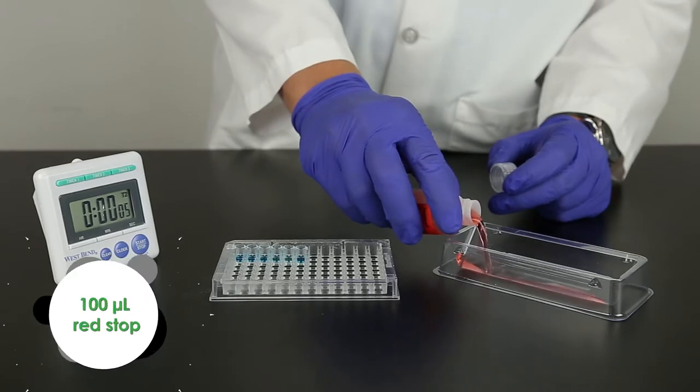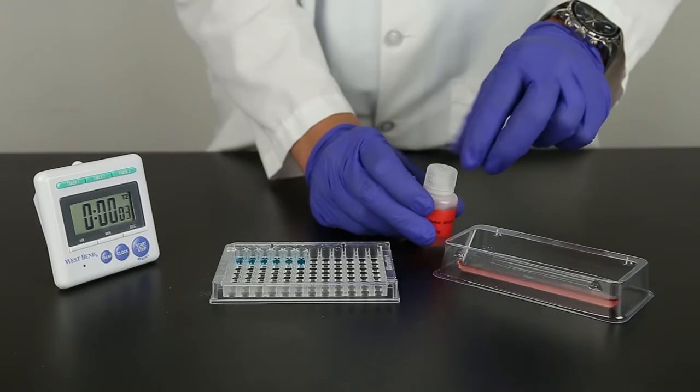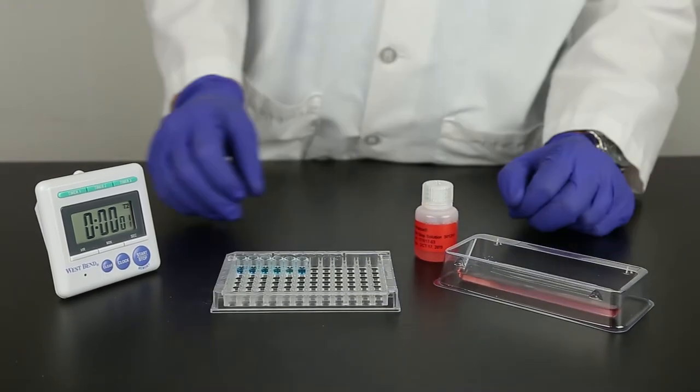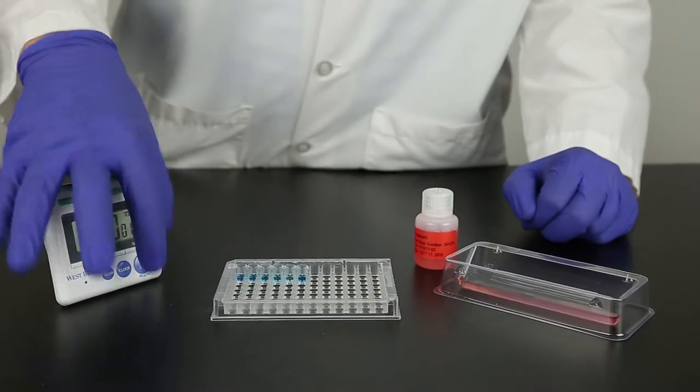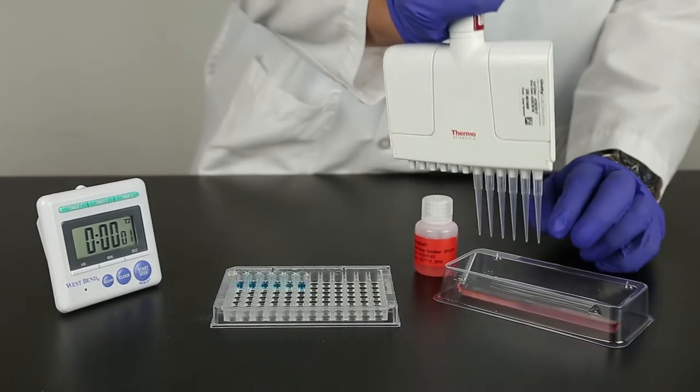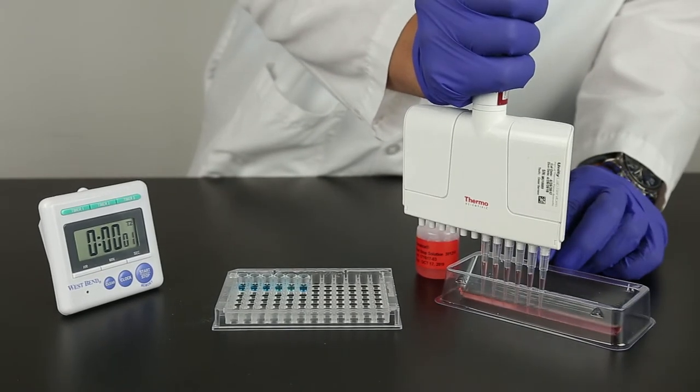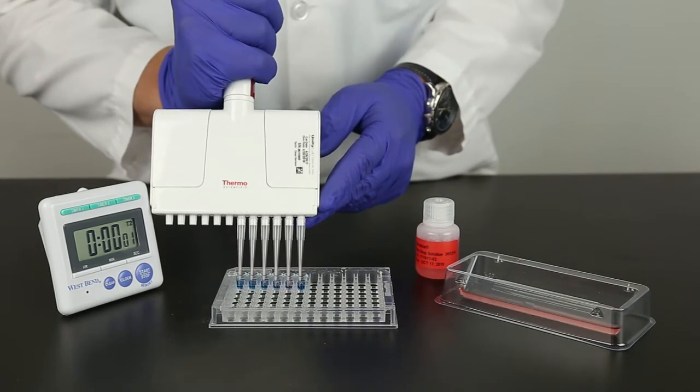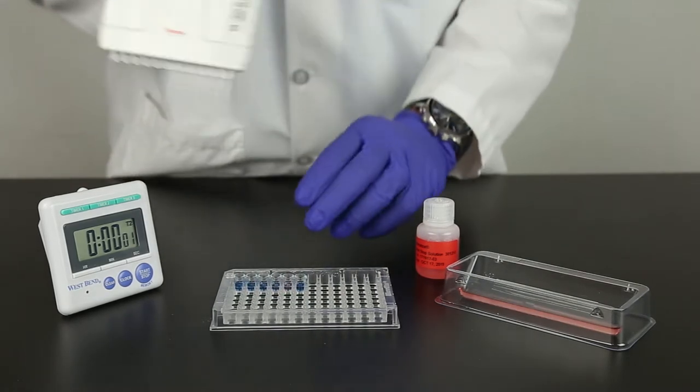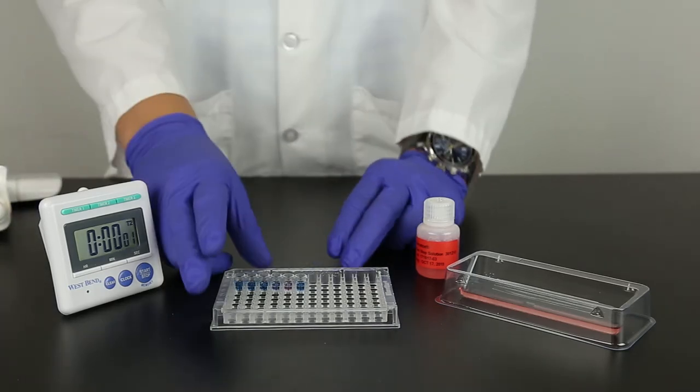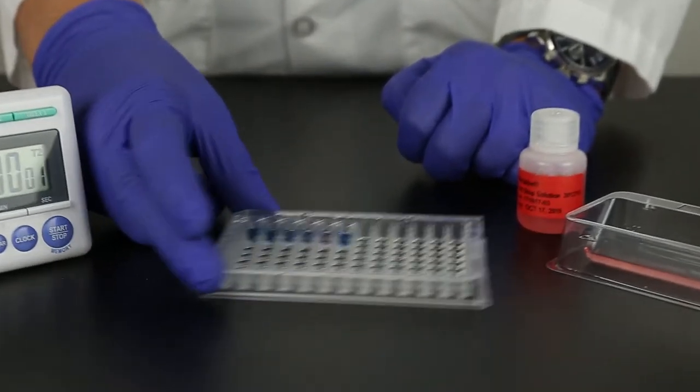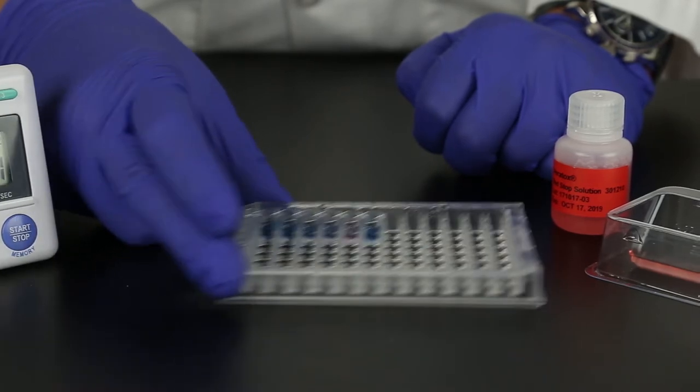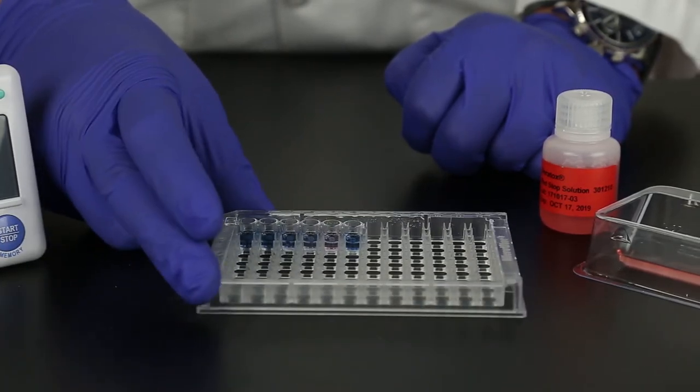Pour the needed volume of red stop from the red labeled bottle into a clean reagent boat. At the end of the five minute incubation, using new tips on the 12 channel pipetter, add 100 microliters of red stop to the wells. This stops the reaction and ends the test. Mix by gently sliding the well holder back and forth. Ensure the liquid is homogenous in color and you do not see any layering.